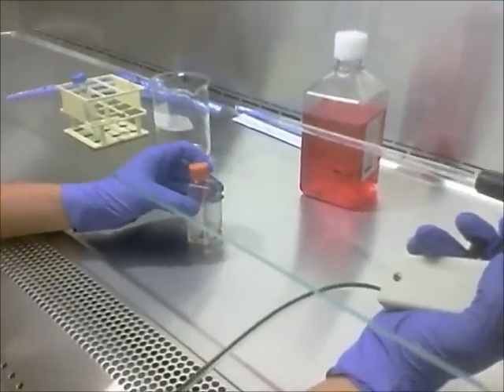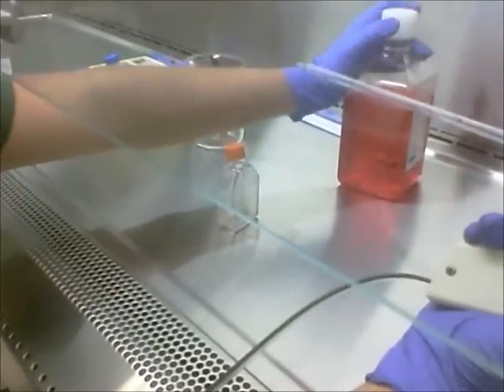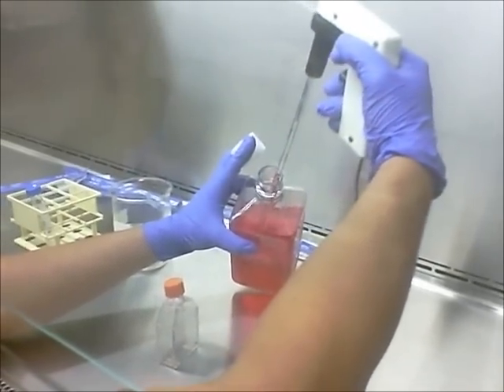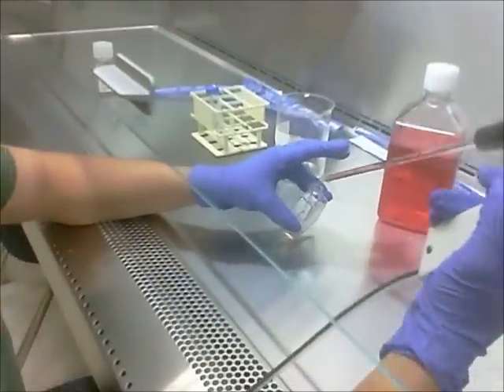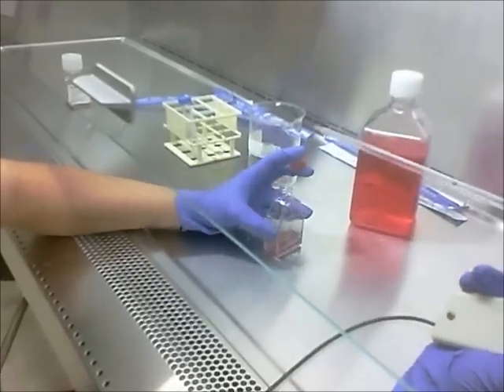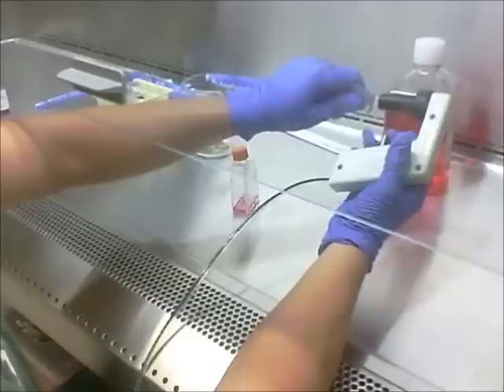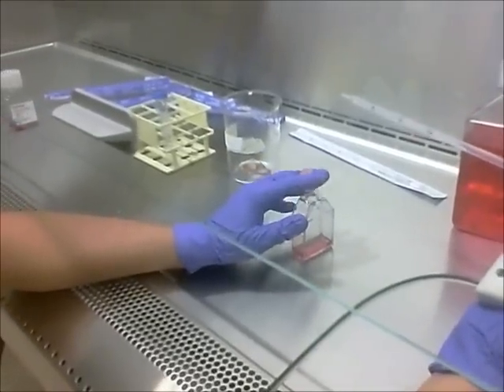To remove the trypsin, we're going to add new media to it and then centrifuge to get a pellet. We'll remove the pellet, resuspend it, and we'll have a new flask. We're going to add the media to our flask of cells with trypsin, then using a new pipette, transfer the media, trypsin, and cells into a centrifuge tube so we can place it in the centrifuge and receive the pellet.